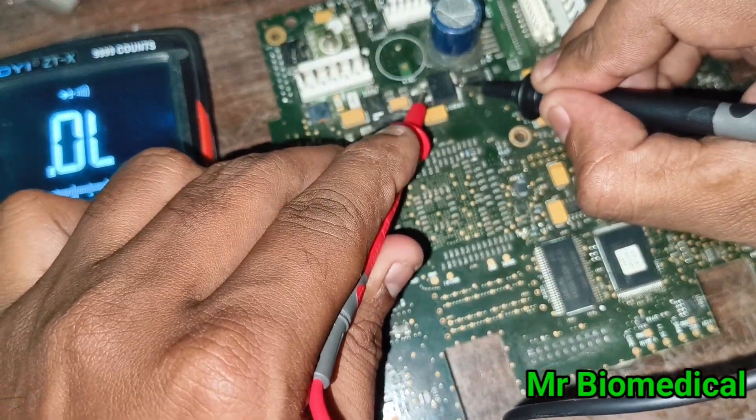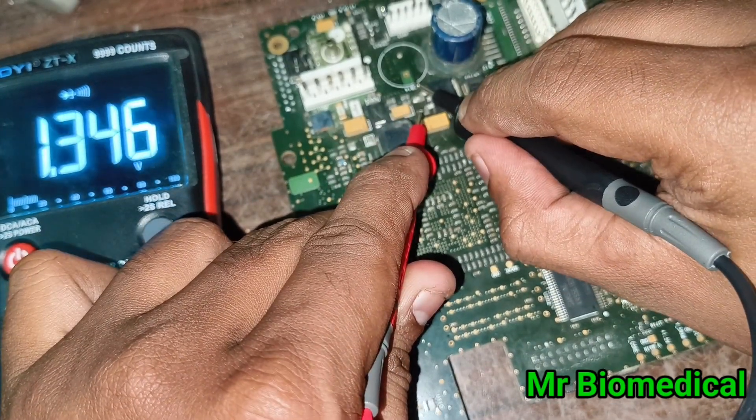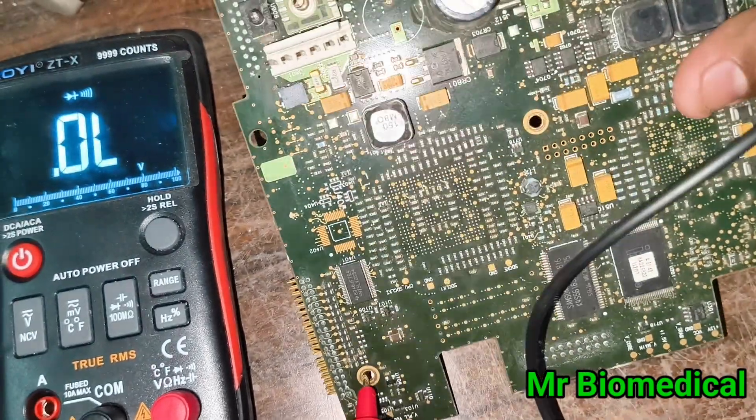There's a transistor over here. You can see the transistor — it's checking good. You can easily check like this with no problem.